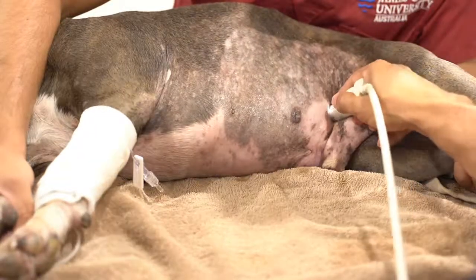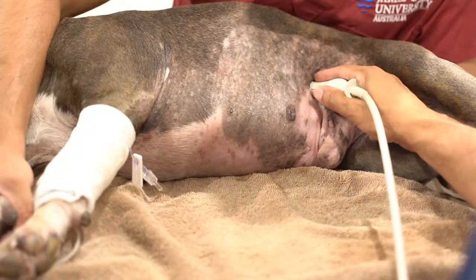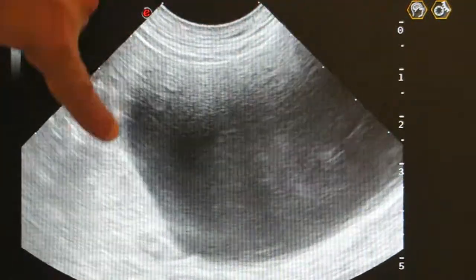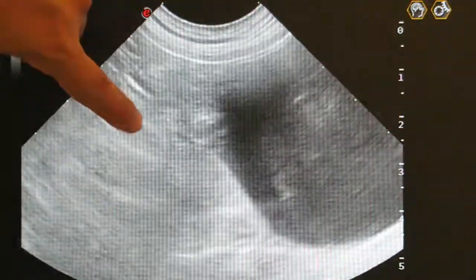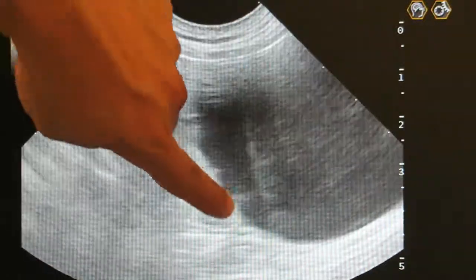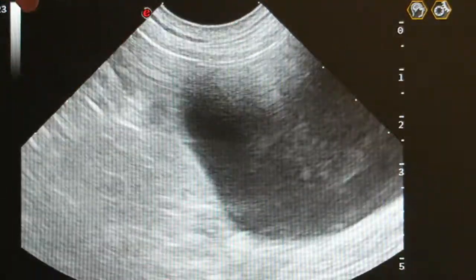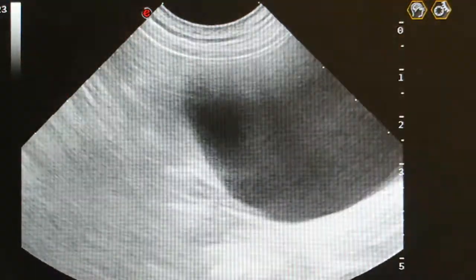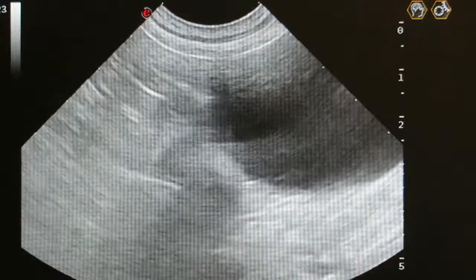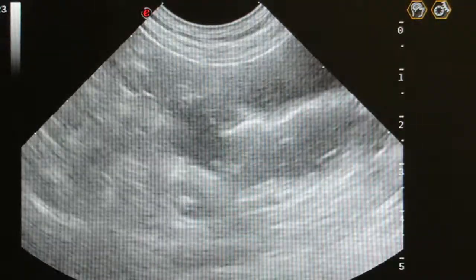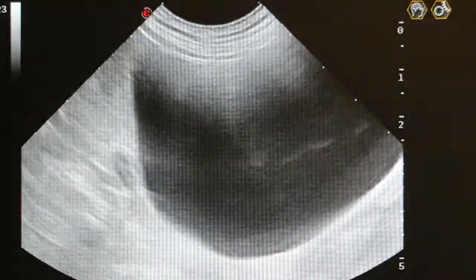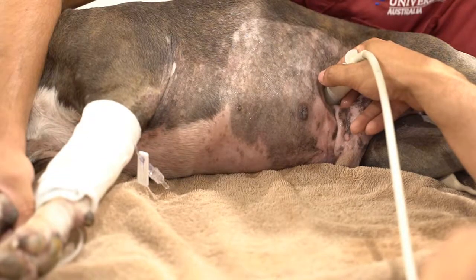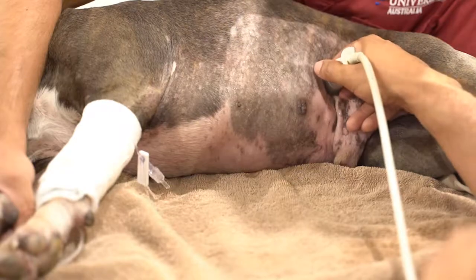Then come across to the cystocolic site, running along the cranial aspects of the bladder. This is the bladder — black is fluid. We're looking for any fluid around the edges of the bladder in the cystocolic pouch. There's a colon with fluid inside, but no free fluid around it. Score of 0.